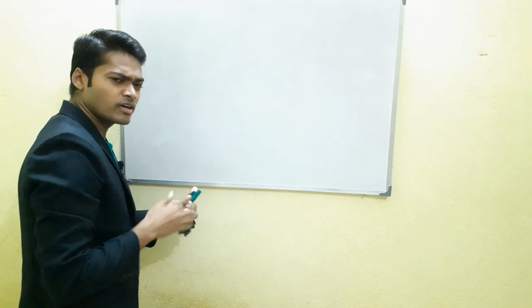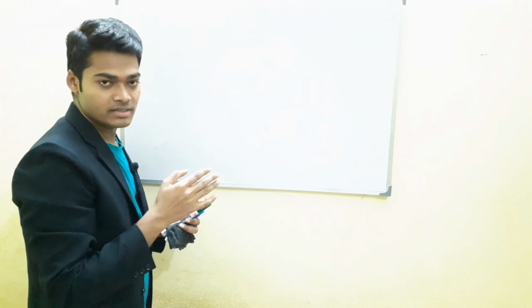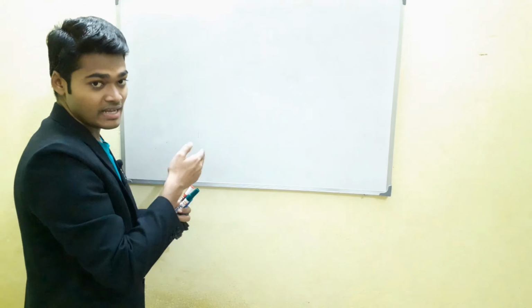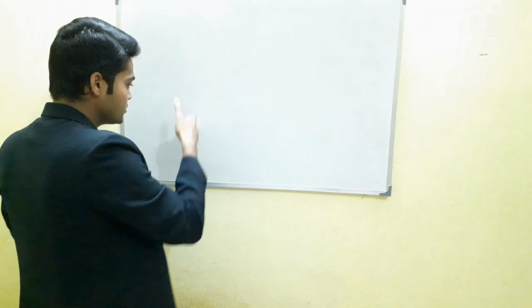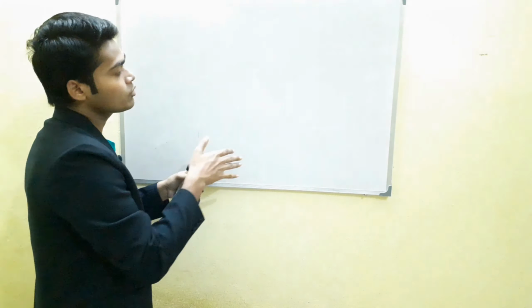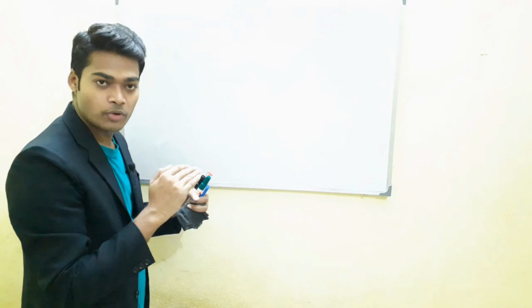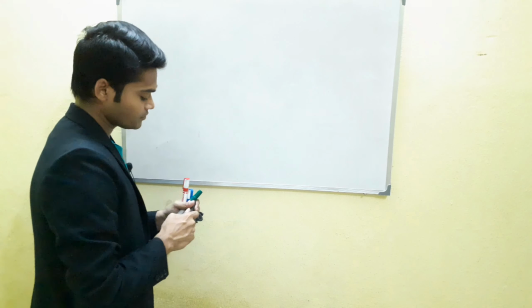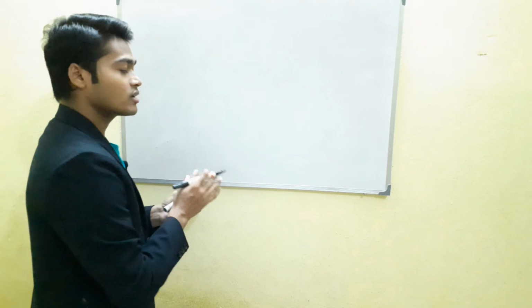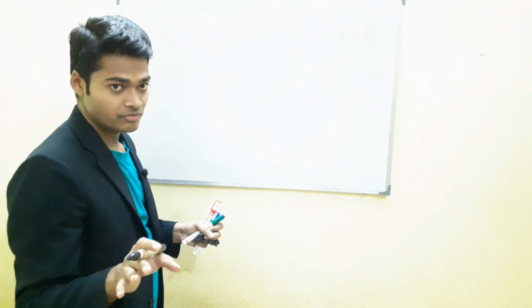The cover test is further divided into three parts: direct cover test, cover uncover test, and alternate cover test, right? And we do this procedure on patients according to their following response, right? If the patient has a manifest squint, we simply perform the direct cover test. Suppose we just instruct the patient to fixate the 6 by 12 letter at a distance, right?